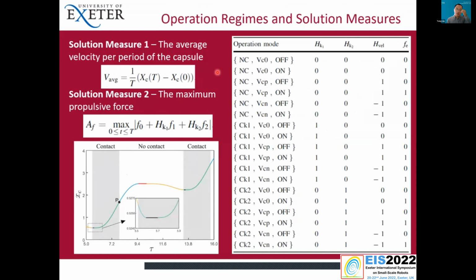We use our mathematical tool, which we call path following techniques. Basically, we follow a desired trajectory of the system, and then we check when the system dynamics will change, maybe a very significant change. We call that bifurcation.